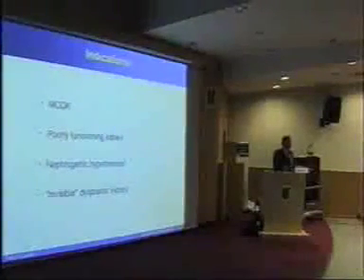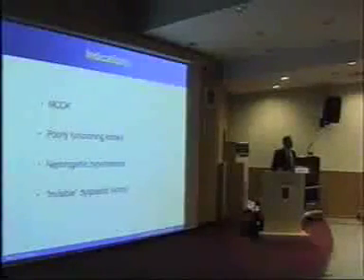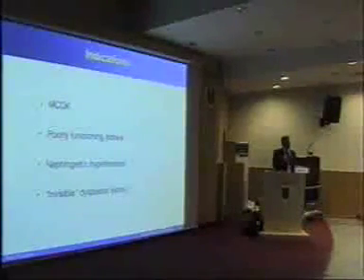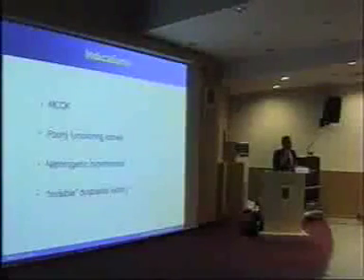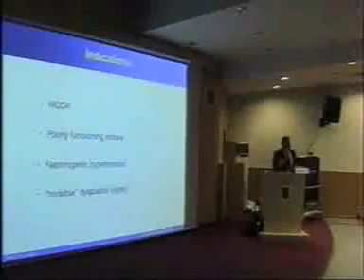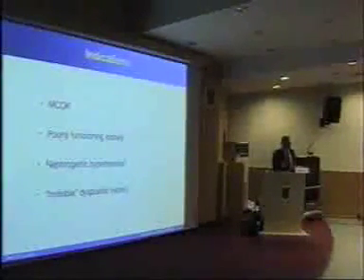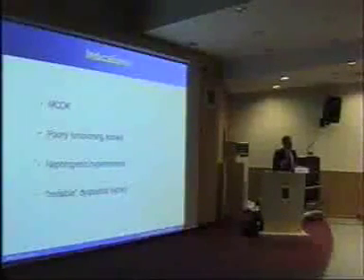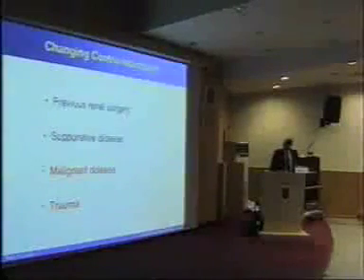Okay, up to 10% of antenatally diagnosed hydronephrosis might be a dysplastic kidney. And so if you've got access to those patients, you'll see several of them a year. Previously the conservative view was pertained, where even a persistent dilatation or cystic kidney after a year or two of age would be left in. Nowadays, our view is that because you can remove it endoscopically, very simply with a minimal stay in hospital, and afterwards you don't have to follow them up, we do a laparoscopic nephrectomy in these patients and then discharge them about 6 months later. So that's our view. And this has given us a large number of patients in which to operate.